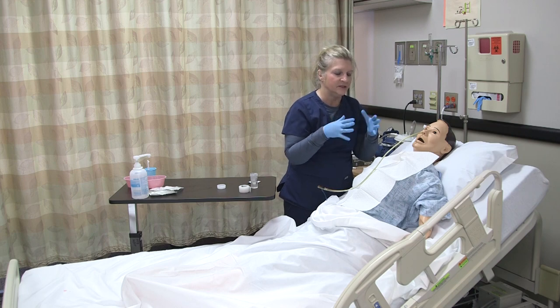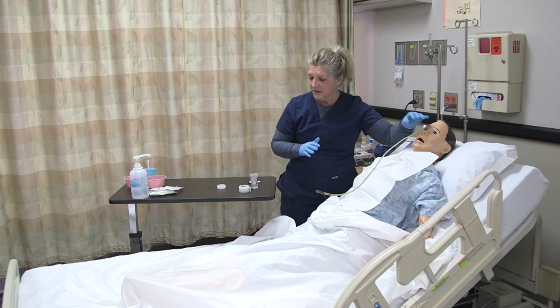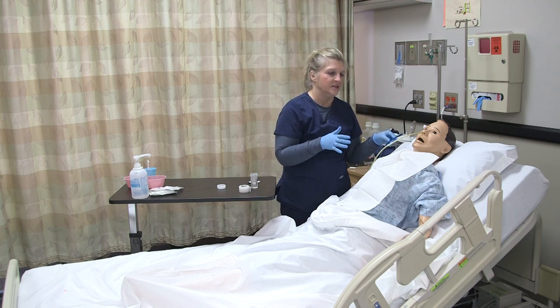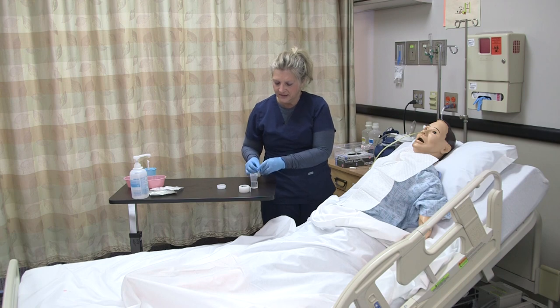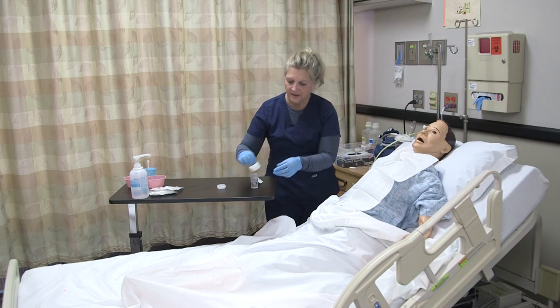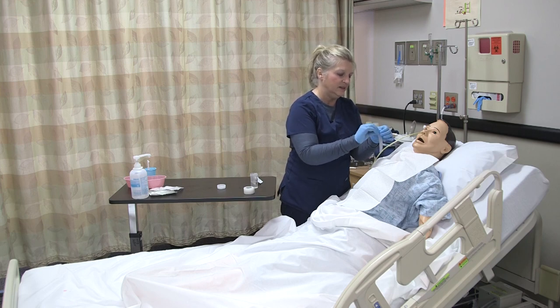Prior to the initial assessment, you also wanted to make sure you did a GI assessment, listening to bowel sounds and performing your typical gastrointestinal assessment for your patient. Now that the NG tube is in, I need to make sure a chest x-ray is ordered — once I'm done and secure it, we'll have the patient get a chest x-ray to verify that it's in the correct place. I'm going to go ahead and use some skin prep on the patient's nose. I don't have a commercial securement device, so I'm just going to utilize tape for this purpose.